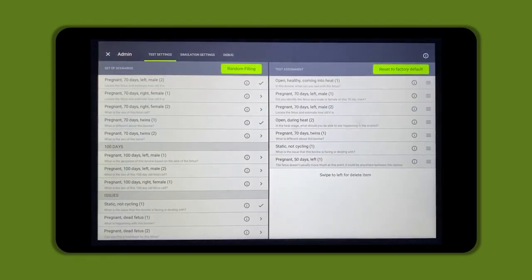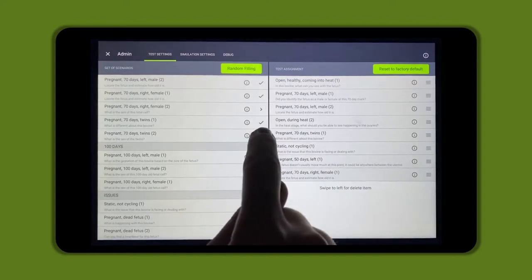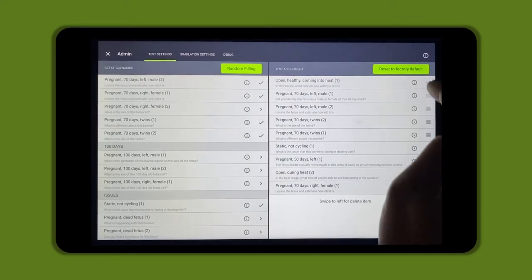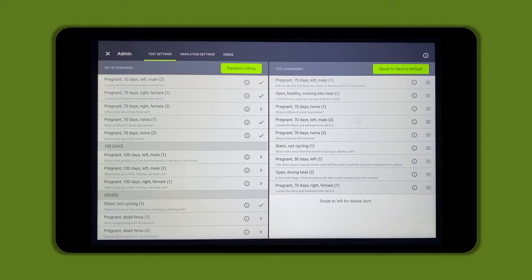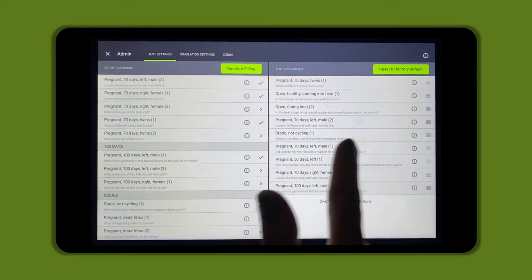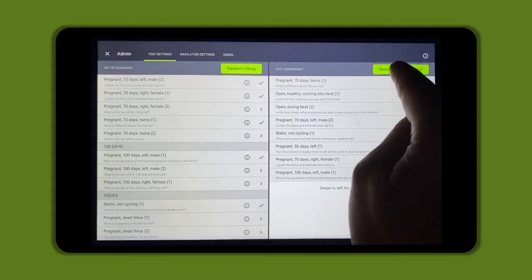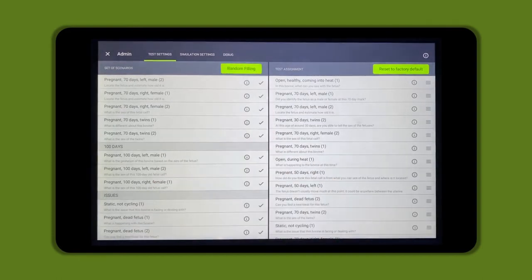To select scenarios and add them to the test assessments that students will have access to, click the arrow icon next to the scenario. A check mark will appear and it'll populate on the test side on the right-hand side of the screen. You can click on the bars on the right side and drag them up and down to change the order of the test scenarios for the student. If you wish to delete a test scenario, swipe left on the scenario and click the delete button that appears. There is a factory reset button to change it to default scenarios, and a random filling button to randomize the test scenarios.